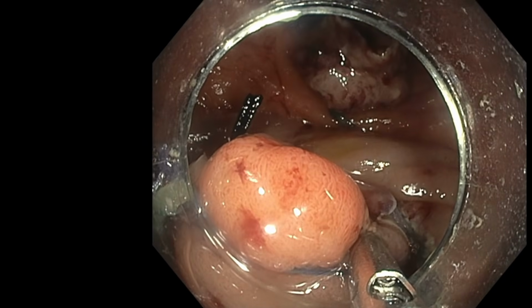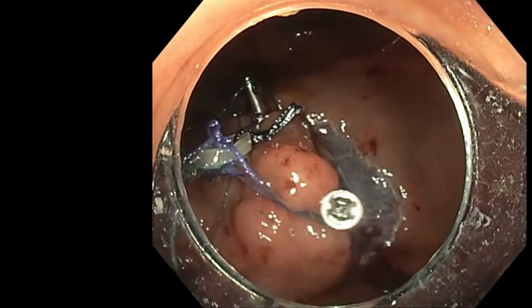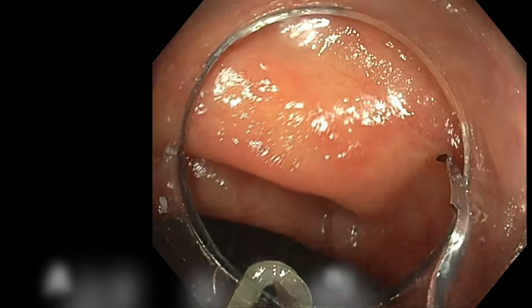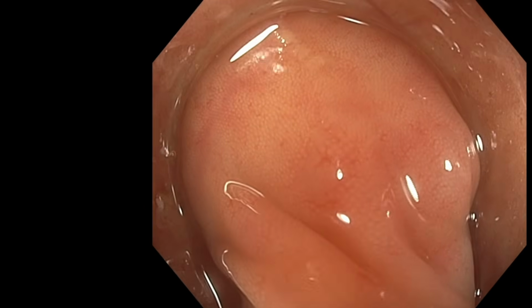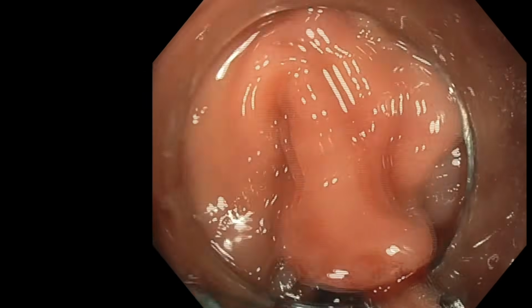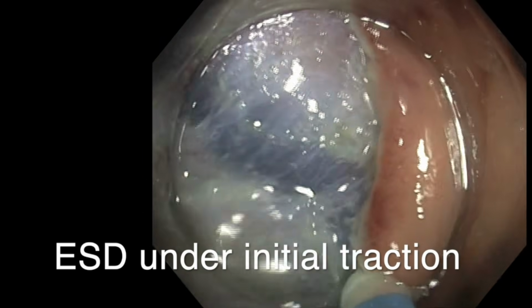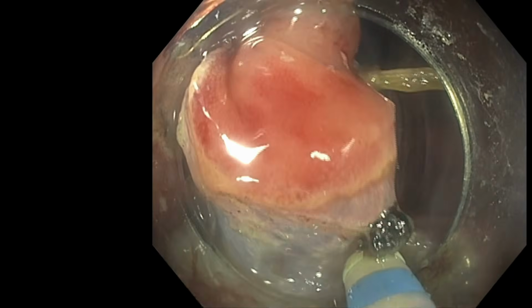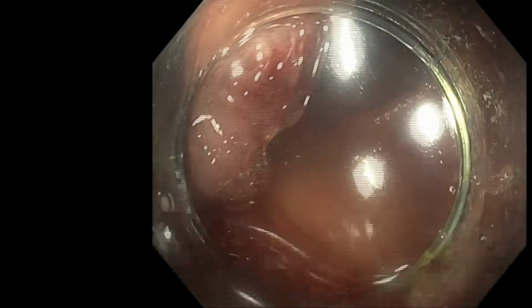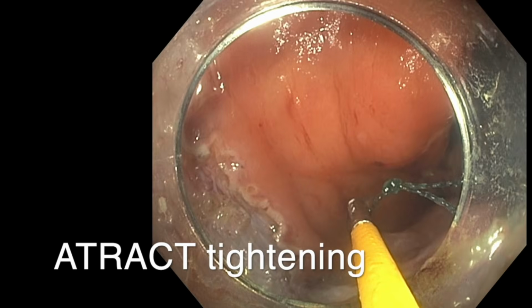And either now or a little later, I will fix the rubber band to the opposite wall in order to get a real 90-degree, if possible, countertraction to open the space and increase the speed of the resection by exposing better the submucosa. So we use a conventional clip, and once you have this traction fixed to the opposite wall, you can see that the exposure is better, and because the fibers of submucosa are stretched to the opposite wall, you will have a better speed because everything is condensed.